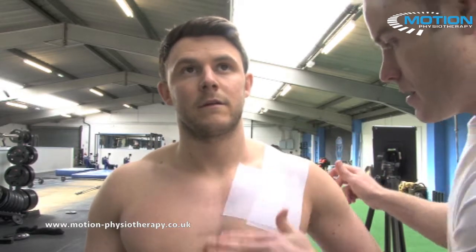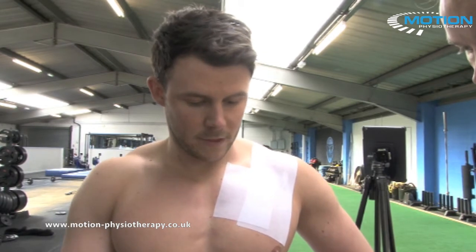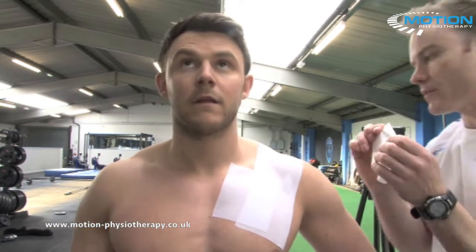If your patient has quite a hairy chest, it's worth them shaving the hair down before this technique to allow the tape to bond better. You may also want to spray them down with pre-tape adhesive before the technique.